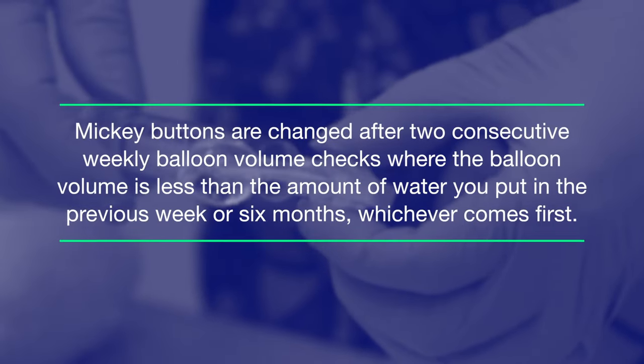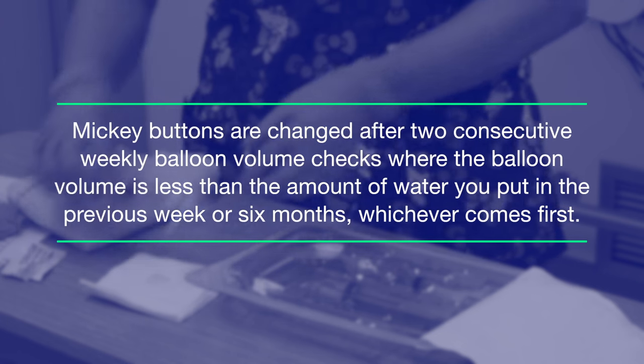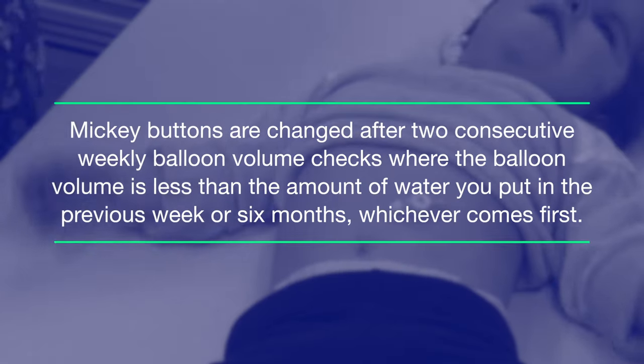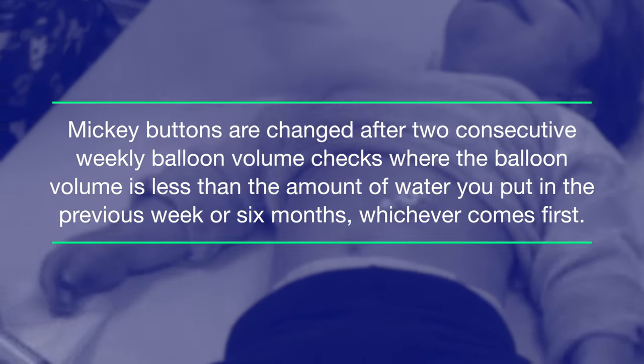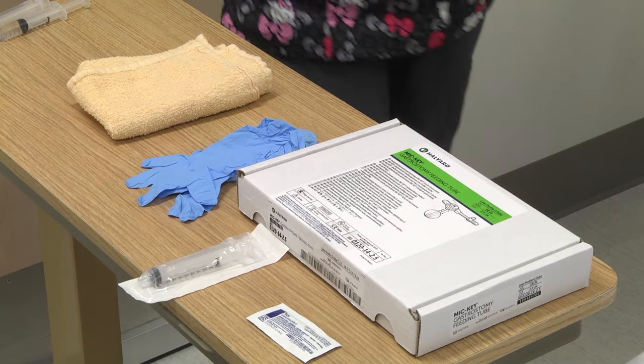Insertion of Mickey G-tube. Mickey buttons are changed after two consecutive weekly balloon volume checks where the balloon volume is less than the amount of water you put in the previous week, or six months, whichever comes first.